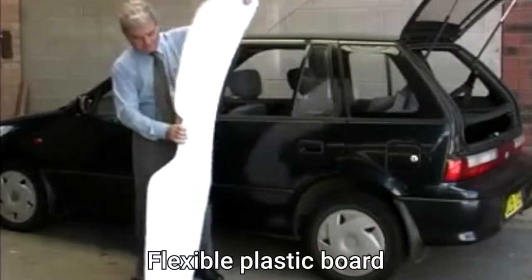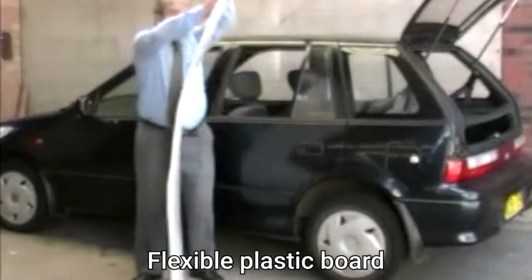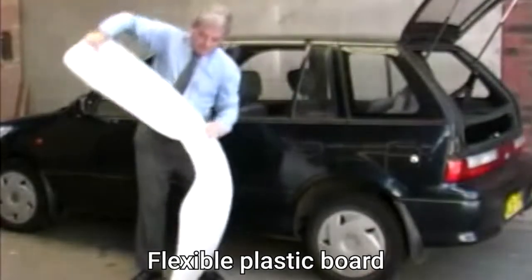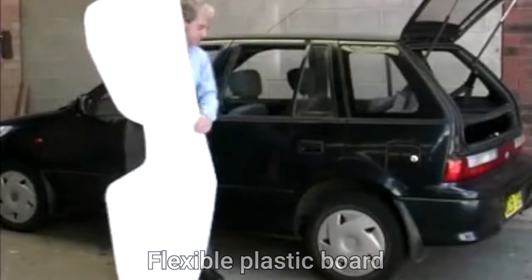This is the Pelican Car Emergency Slide Board. It is a very strong and flexible board that will bend without breaking. The flexibility of this board makes it extremely useful when evacuating unconscious people from a vehicle.